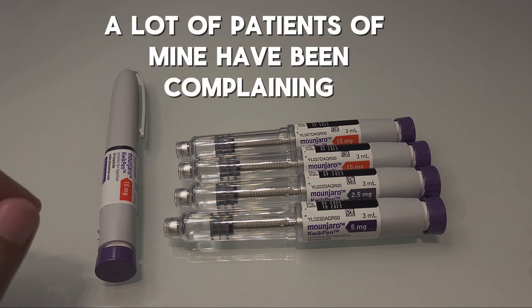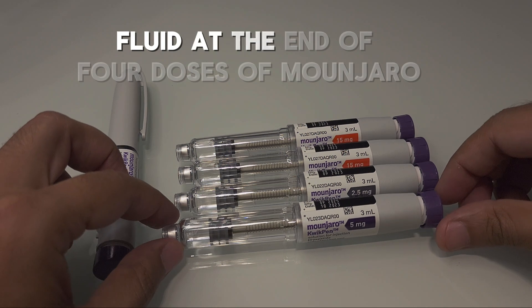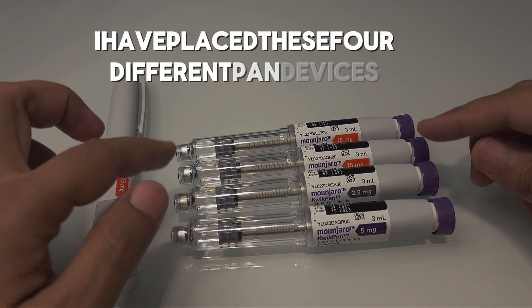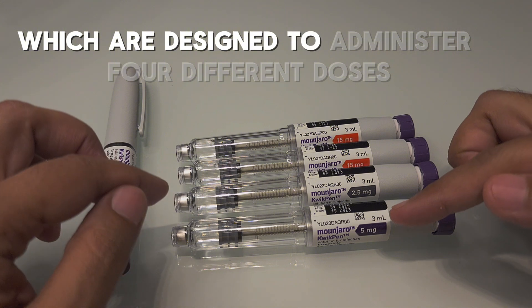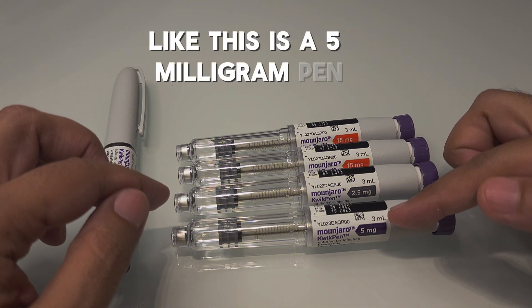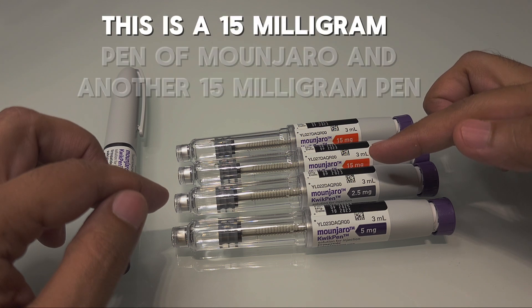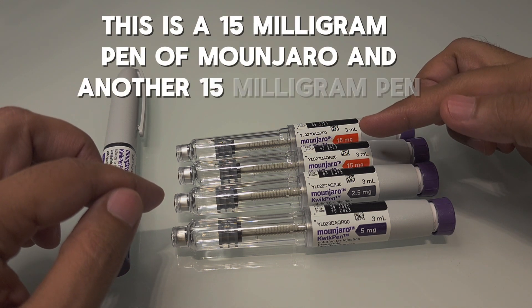A lot of my patients have been complaining about some leftover fluid at the end of four dosages of Mounjaro. I have placed four different pen devices here, which are designed to administer four different doses: this is a 5 milligram pen, this is a 2.5 milligram pen, this is a 15 milligram pen of Mounjaro, and another 15 milligram pen.